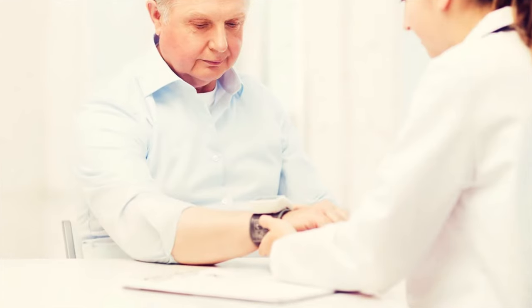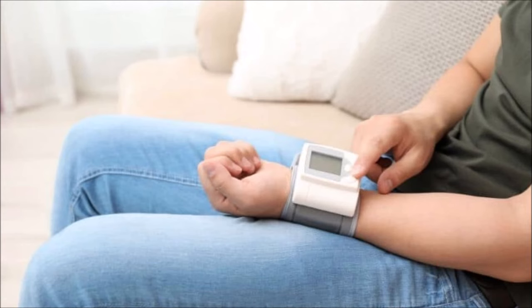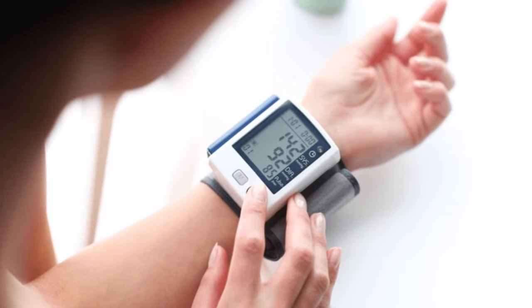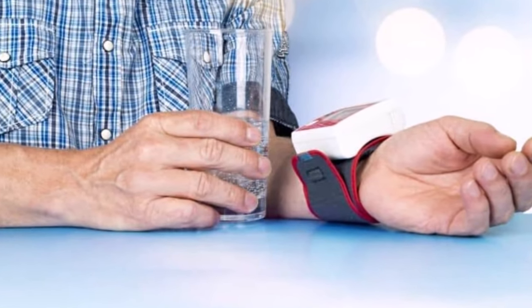That is a common mistake people make when using a wrist monitor. They hold their arm in the same position they would with an upper arm monitor, but when they do that, the cuff, which is wrapped around the wrist, is down below the level of the heart.